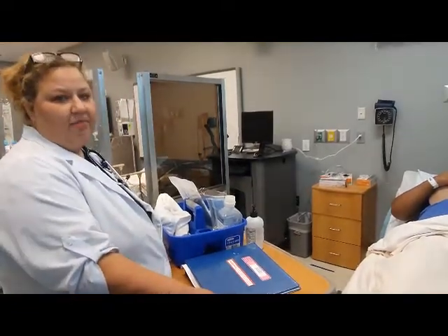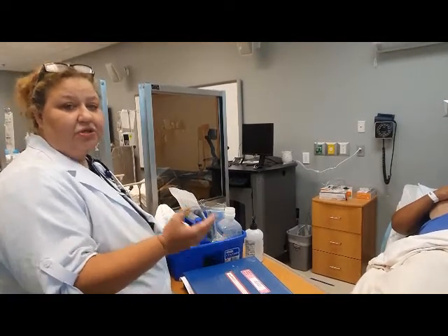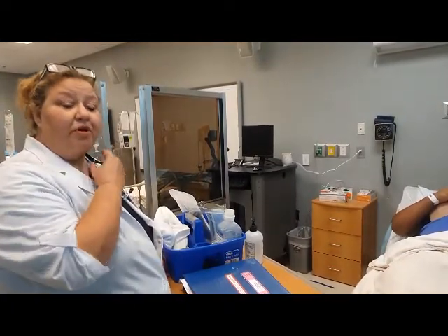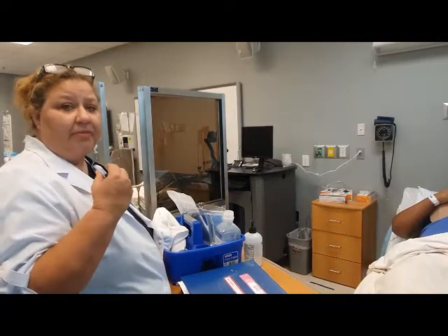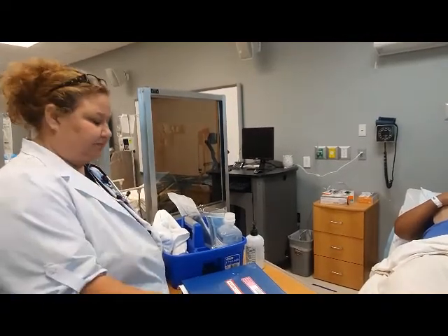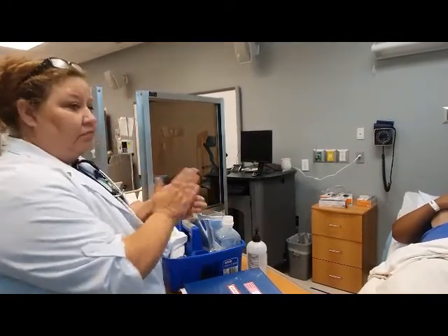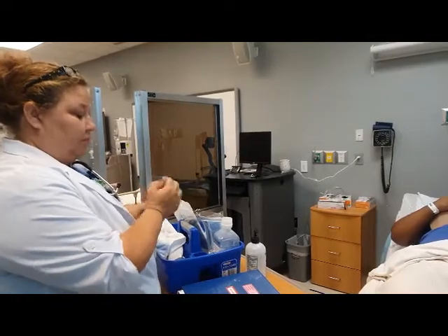So at this time, I would ask someone to assist me in order to later remove the oxygen source and bag mask the patient before suction begins. Then you'll introduce yourself and identify the patient with 2 written identifiers.